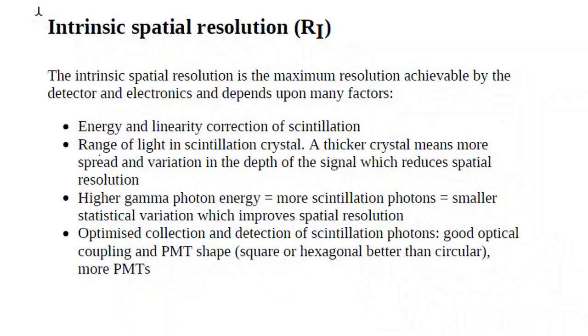So, calibration means you are making a pre-adjustment for your detectors. This term is generally used in CT, X-ray, and any imaging modality. The term calibration means you are calibrating the machine. What does calibrating the machine mean? It means adjusting its settings, making a pre-adjustment so that it can recognize the object it will detect. When I perform quality control, I take this source and place it under the machine or the source of radiation and see if the machine reads it correctly or incorrectly. This is called quality control.